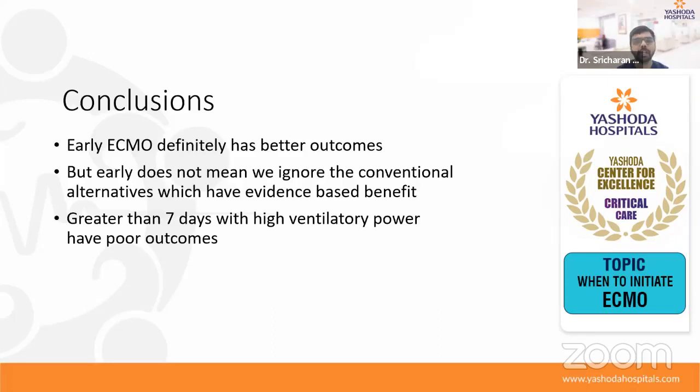where his PF ratios are hardly coming between 100 to 120, and the compliance is getting poorer by the day, I don't really think it is better to hold off ECMO and then continue prone ventilation. So in these patients, ECMO initiation has to be done quite early.